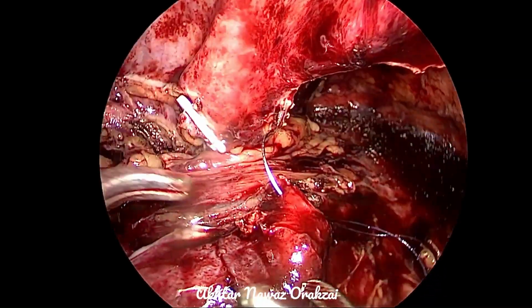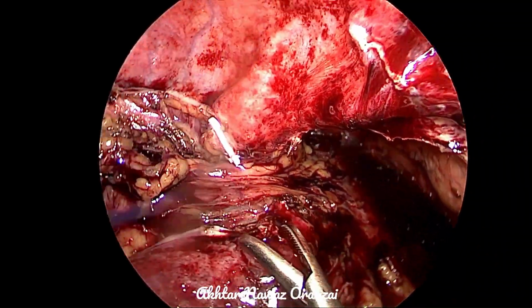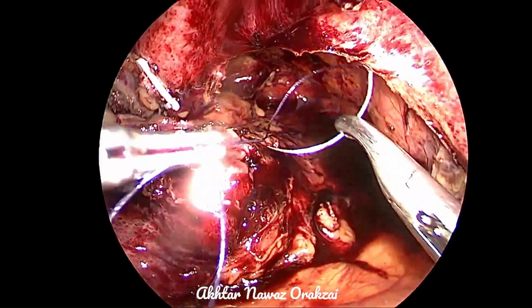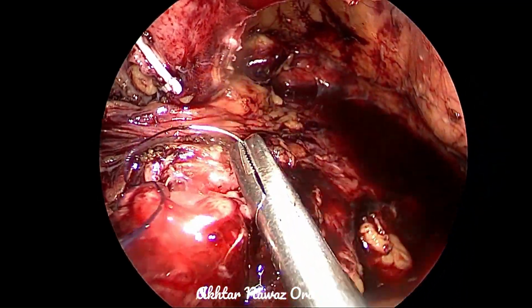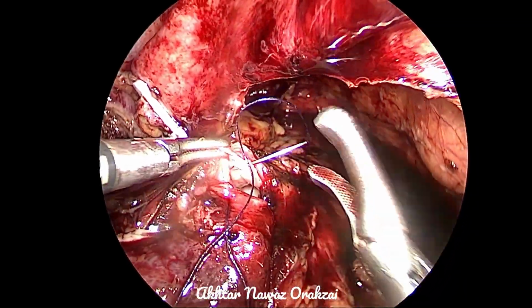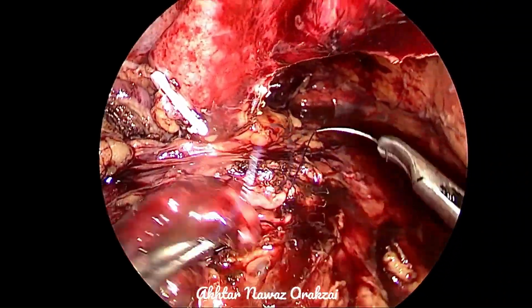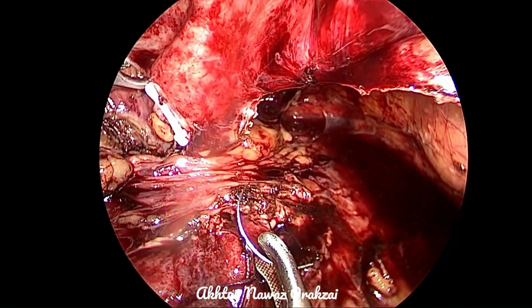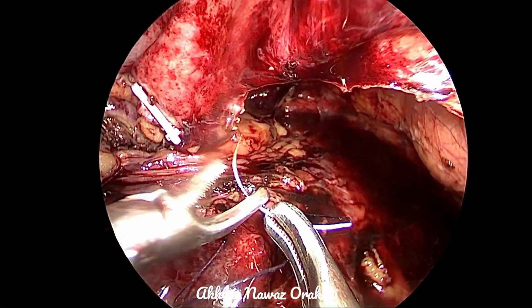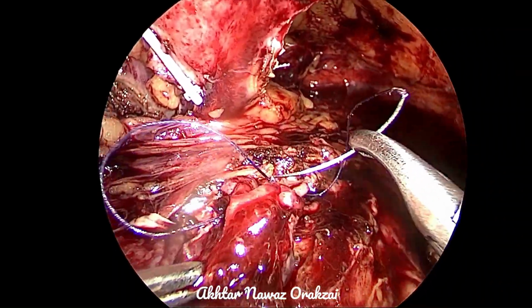Four interrupted sutures can also be taken, one at the apex, one at the corner, and 2 on the left and lateral wall. But continuous suturing can also have a watertight effect. Number 1. Number 2, repeated knotting is prevented.